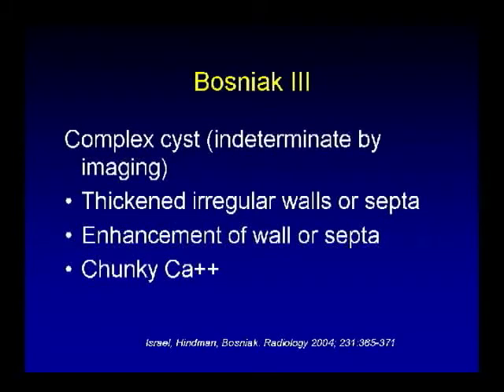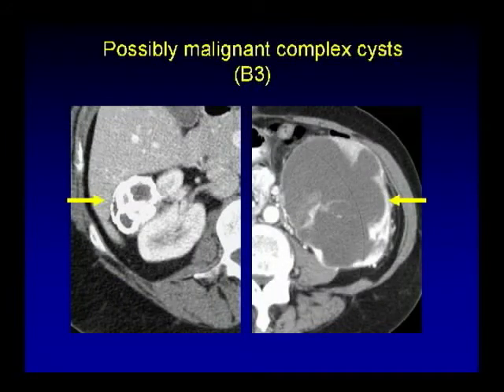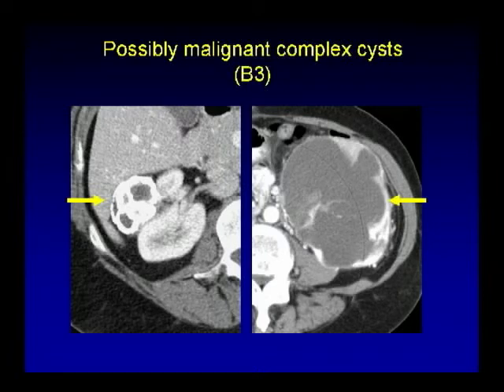Bosniak 3 cysts are complex cysts that are indeterminate by imaging, so they have features with thickened irregular wall septa, enhancement of the wall septa, and chunky calcifications. Here you see two examples: on your left a cystic lesion with irregular chunky calcification, and on your right a large cystic mass with irregular enhancement of the wall and septum — possibly malignant complex cysts type 3, needs surgical resection.